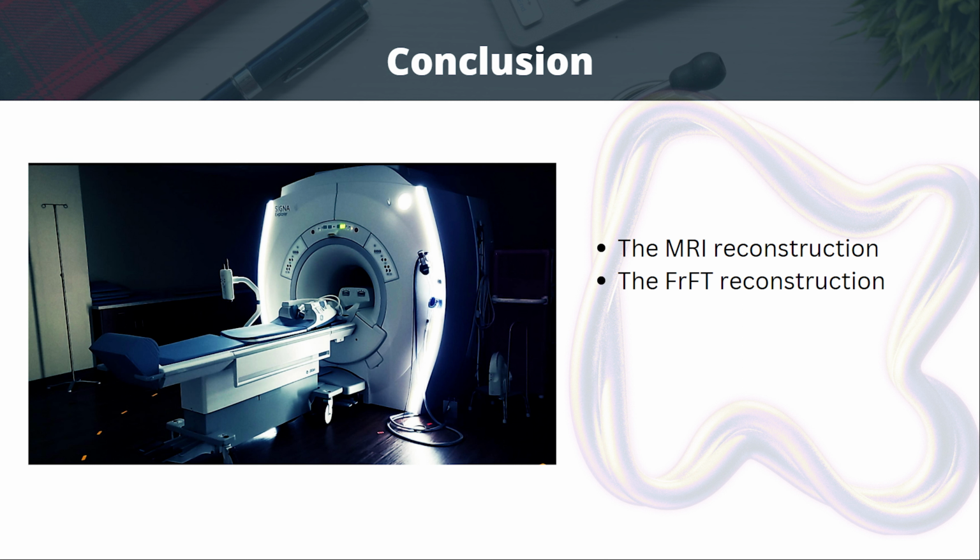The FRFT reconstruction with a fixed order for the entire readout corrects phase, and a fixed order for each echo in a multiple echo trajectory corrects geometric distortion as compared to the traditional FT. From a practical point of view, this is an important improvement when the reconstruction time is important, because the FRFT can be computed with a fast algorithm.